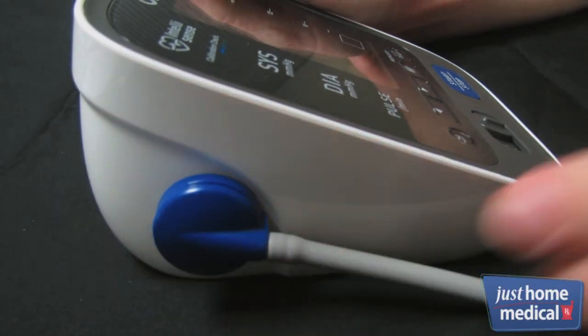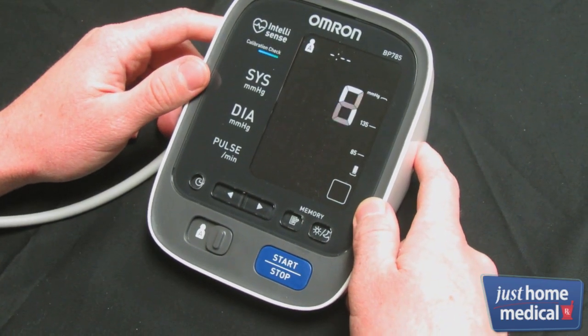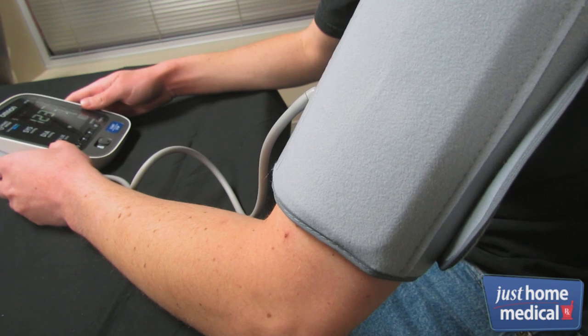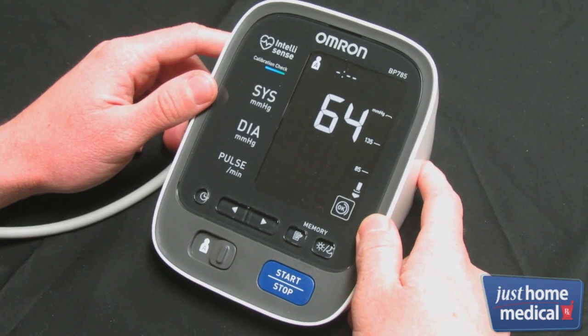Turn the unit on by pressing the start/stop button. The cuff will tighten and inflate automatically, and a reading will be taken. Hold still until the cuff deflates and your results are displayed.